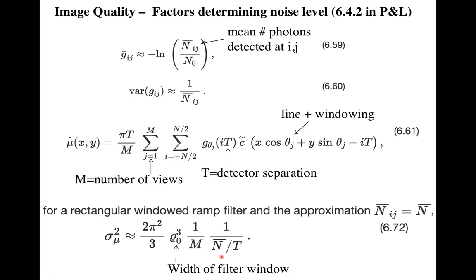And the great thing about CT and trauma is that a person can be put on the table with tons of stuff, like clamps and lines and ventilators, and all this stuff can be on that patient, and you just put them on the table, put them in, and then in 5 seconds you've got the picture. And in 5 seconds often you know what's going on. Like, do you need to go in and put some big old stent in that person's aorta? Right? So that's that.